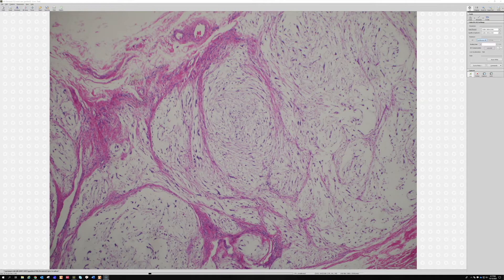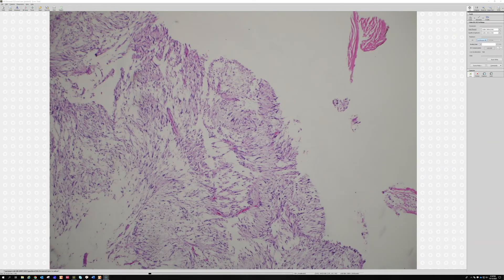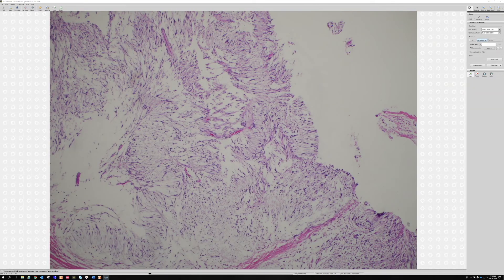Why I like this case: early in my practice, I saw those palisades and thought maybe there's a myxoid multinodular variant of schwannoma. When I looked that up, a paper about nerve sheath myxoma came up — I think it was by Dr. Mietinen, Fetch, and Laskin. They wrote a nice paper and said that things previously called myxoid variants or multinodular myxoid schwannomas are actually probably nerve sheath myxomas. That proves the concept that they really are nerve sheath tumors.